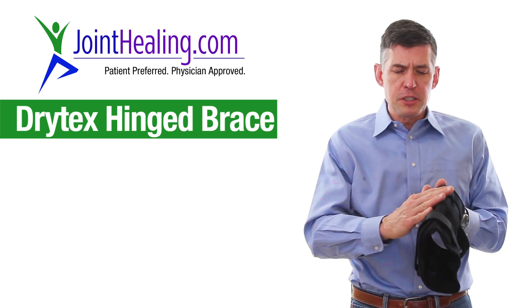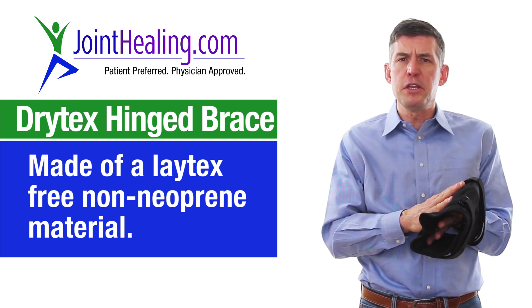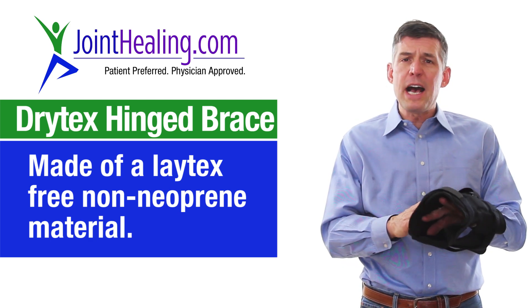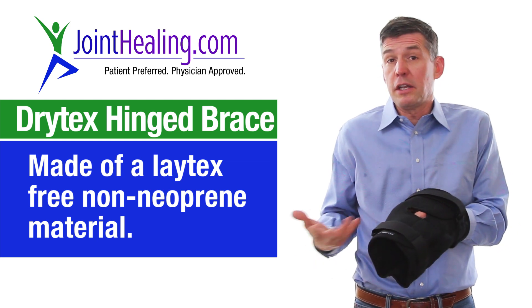This is called the Drytex Hinge because the material is called Drytex. This is a non-neoprene, non-allergic material that's very breathable. You'll be surprised when you wear this at how much your leg doesn't really sweat — it feels like natural clothing.